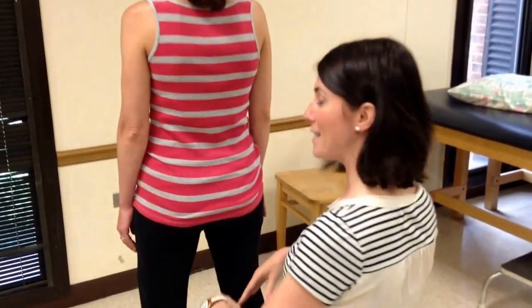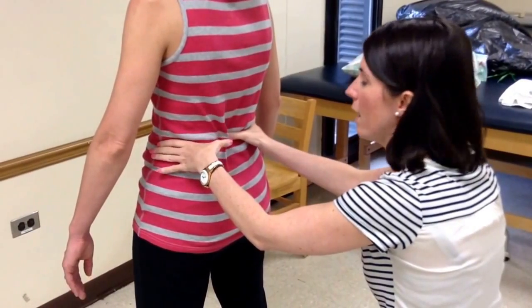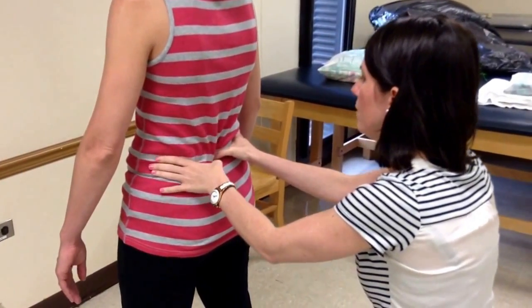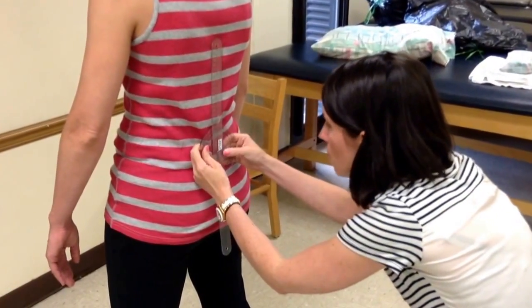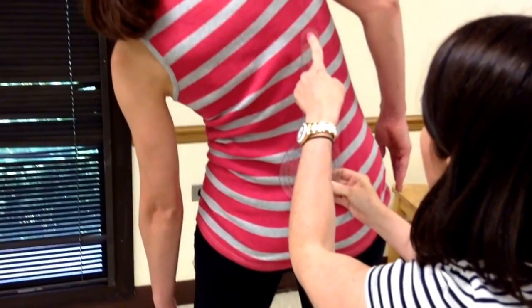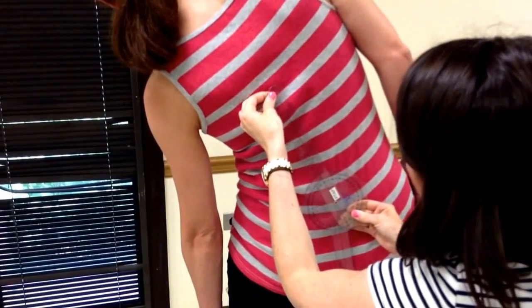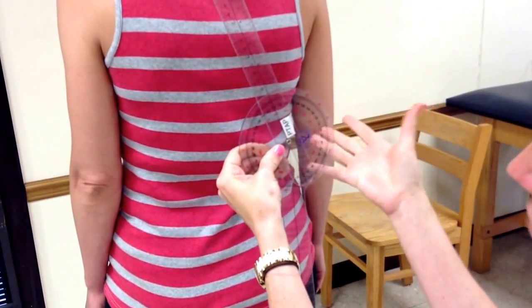I'm going to palpate her S1 spinous process. Coming in over her iliac crests across — that's approximately the L3-L4 junction. Inferior to that is L4, then L5, then S1, and that's where my fulcrum goes. My stationary arm is perpendicular to the floor. Suzanne, bring your left hand down your left leg. I line up my moving arm with the C7 spinous process. The goniometer is reading about 19 degrees.